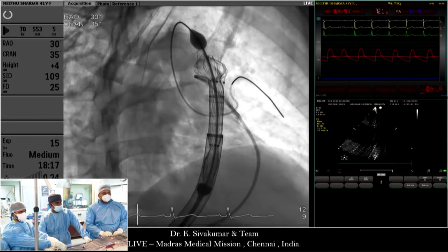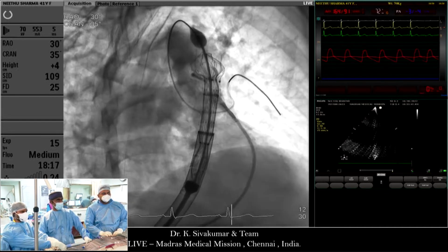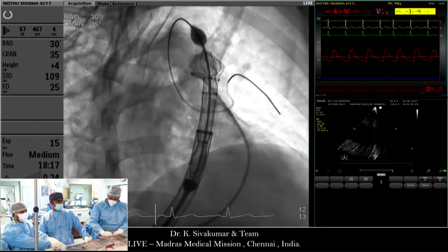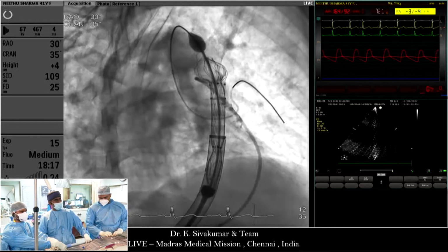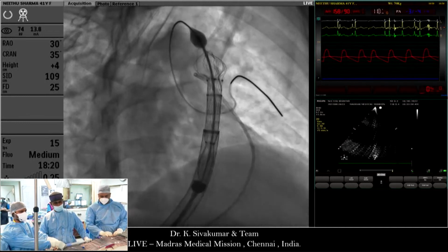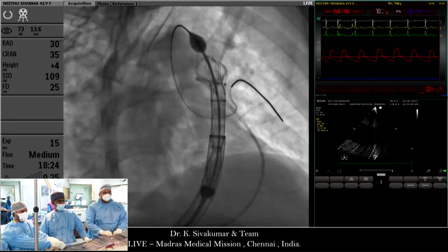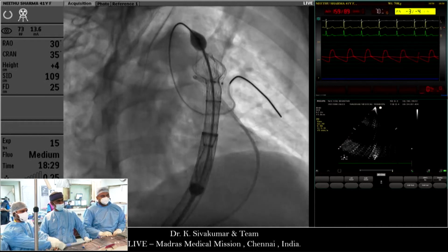Okay, I am at the distal flare. The gold markers are at the LPA origin now. I will open a little bit more for the flare to open up, and then I will adjust further. So I am keeping my wire and my sheath rigid while Pramod is now opening out a little bit more. Ramkishore is controlling the proximal groin sheath.